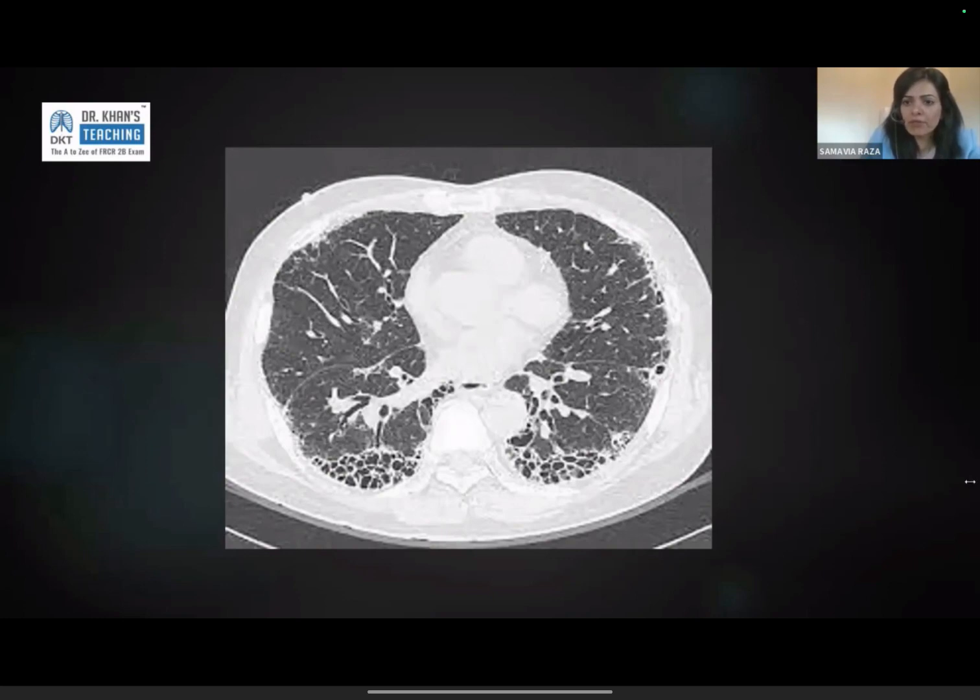If you ask me another question higher up, can we use emphysematous cyst or just cyst? You cannot use emphysematous cyst, because emphysema means destruction of the lung. Cyst means a space occupying lesion. A cyst can be a tumor, a bronchocele, a pneumatocele, or congenital. So don't call it emphysematous cyst. Call emphysema, emphysema, and cysts, cysts. And I hope you would attempt to differentiate between the two.